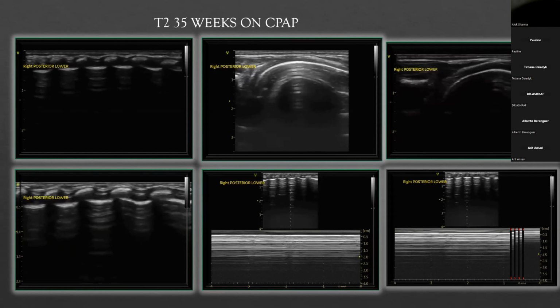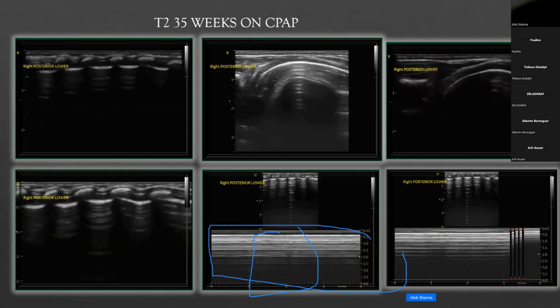But if you have an air bubble, a small anterior pneumothorax in the middle of different areas of sliding, then what you should get is a seashore sign alternating with the barcode. But here I'm seeing a barcode in its entirety, and the fact is that there's sliding everywhere.